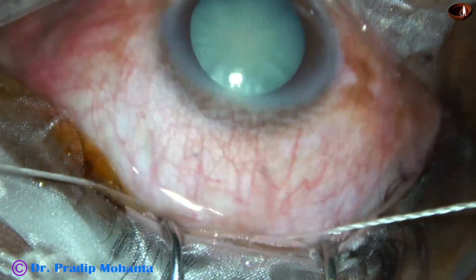I advance into the clear cornea from the center, and now I sweep backward and to the left, making the left side of the tunnel. Then I go to the right side — from center I sweep backward and to the right, and from center to the right, this portion of the sclerocorneal tunnel is completed.